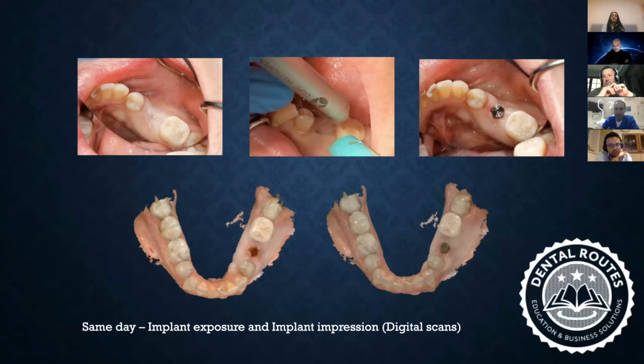So it's like a super tool, really, because using any other method has a risk to it. You can predictably, one in 100, one in 1,000, make a mistake and actually tear the membrane. I'm guessing that with the laser it won't happen. Is that right? You're absolutely right, Chris.